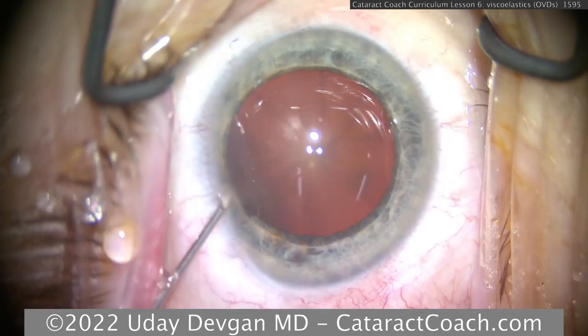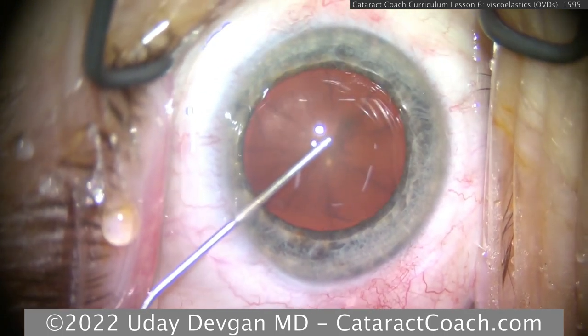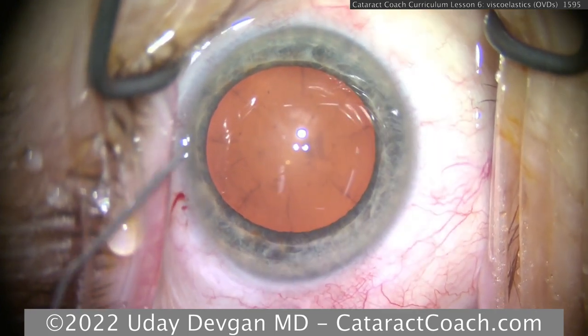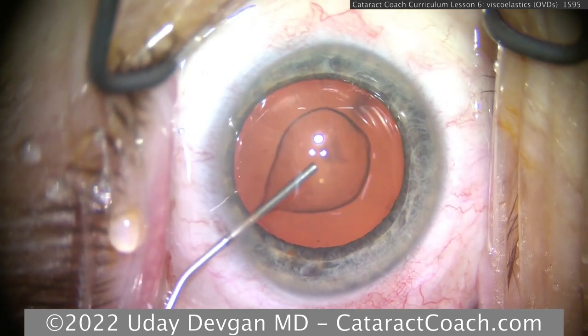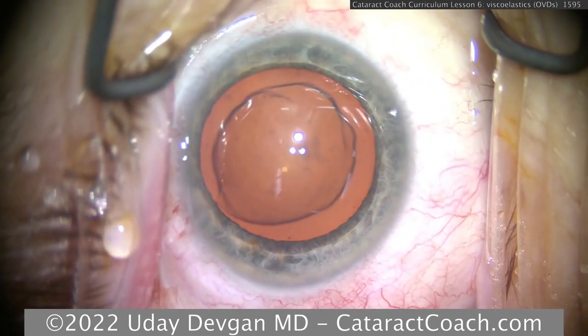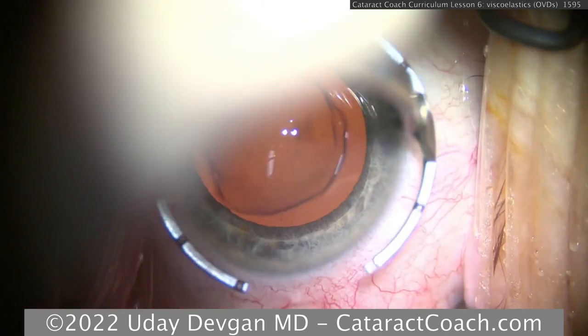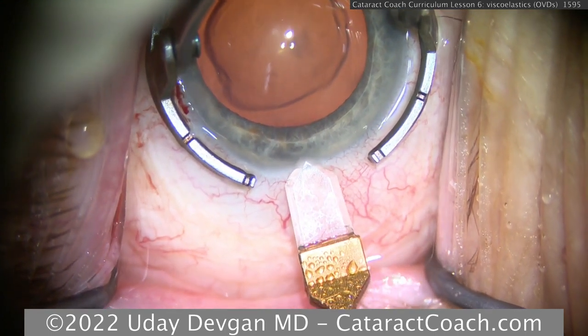So we'll put the dispersive viscoelastic in, and we want to aim it towards the endothelium. Obviously, don't touch the endothelium. Now we'll get our cohesive viscoelastic and inject it under that. And there's the cohesive going in. That has two benefits. One, it deepens the AC and maintains the space. And two, it pushes the dispersive up against the corneal endothelium to protect it even more.